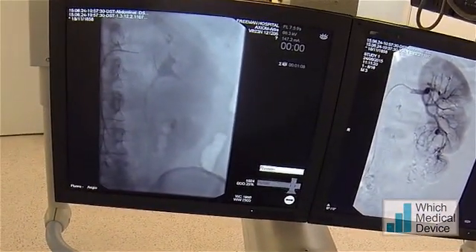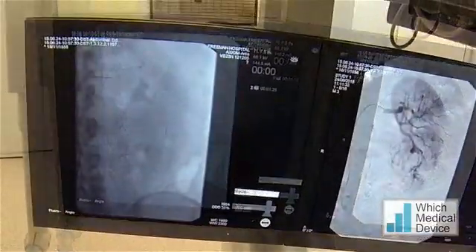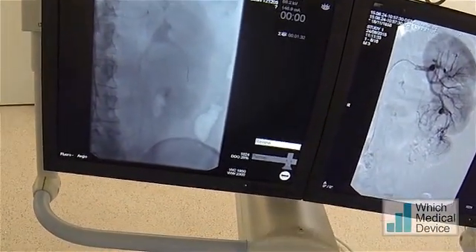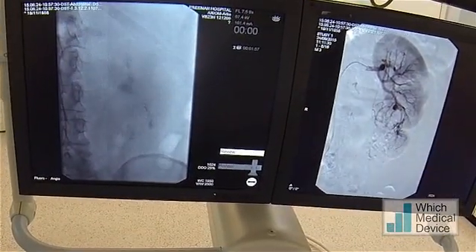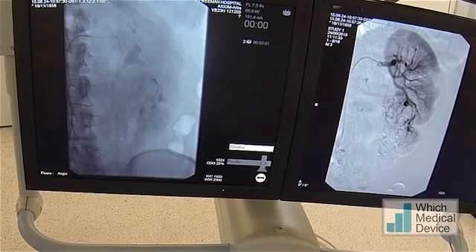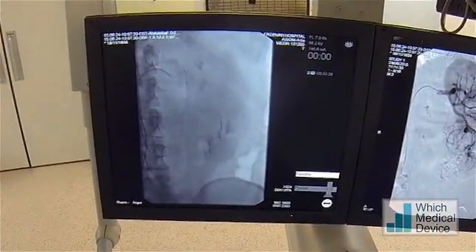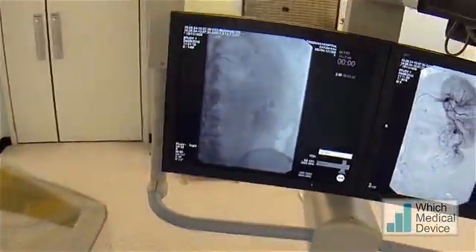We're just trying to get down into that lower pole vessel - that's looking promising. The wire is down, and I'm just going to try and advance the Prograte catheter over the wire down into that lower pole. Retracting the microcatheter and going down one of those more medial branches. We're down in a fairly small group of vessels now.